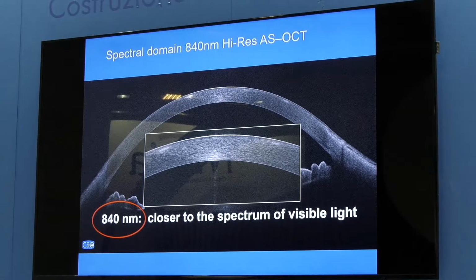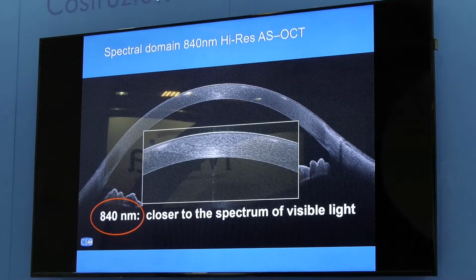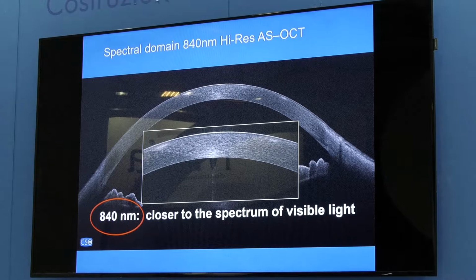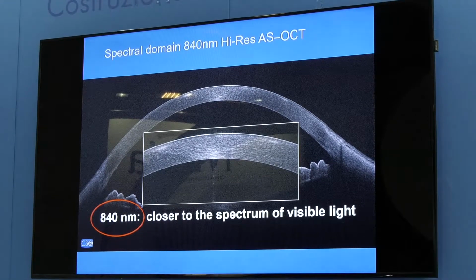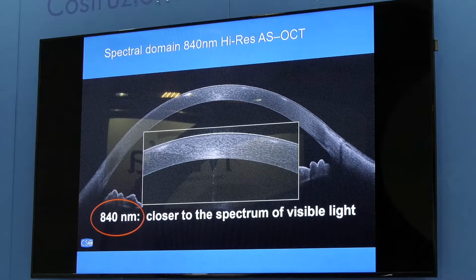So whenever we see even the faintest opacity within the cornea, and we have a look with this kind of OCT, we can readily have a precise definition of that opacity. It's not by definition something we can use for defining the optical density, but there is an extremely strong correlation with the opacities we see at the slit lamp, and sometimes also opacities that we cannot see. And you see the definition we can have with this machine.